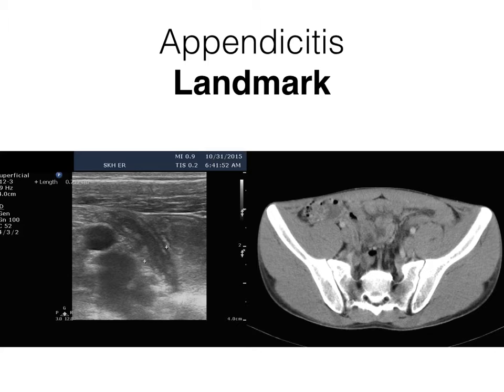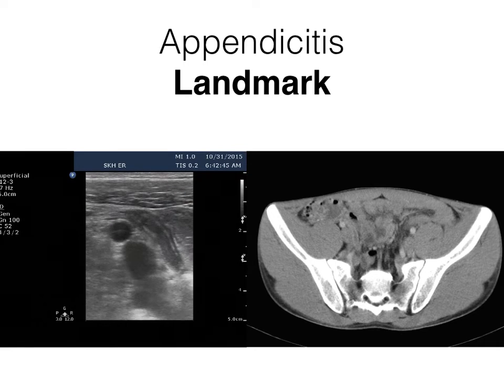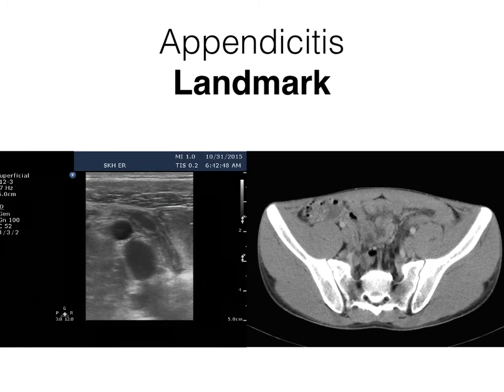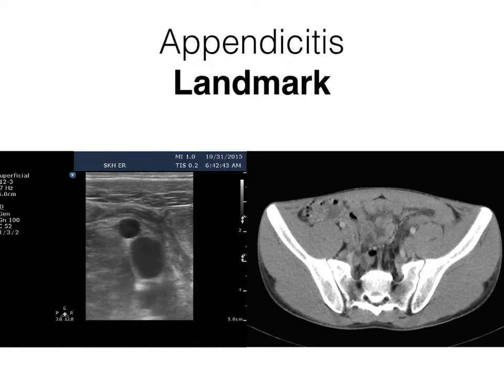So move your probe based on this landmark and slide to the pelvis, or slide to the upper part, based on the patient's clinical presentation. Because when you gradually compress the probe, the patient's most hurting area definitely tells something, just like this one. The anatomy comparison, the iliac vessel, and this is the appendix, right here.